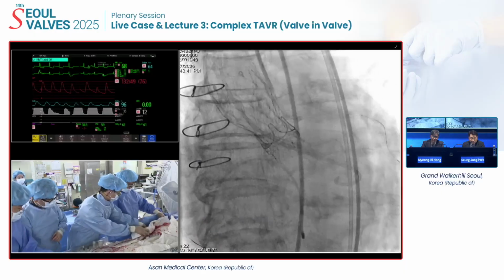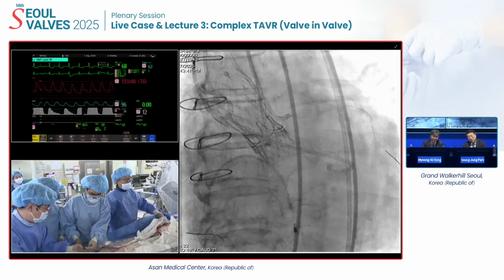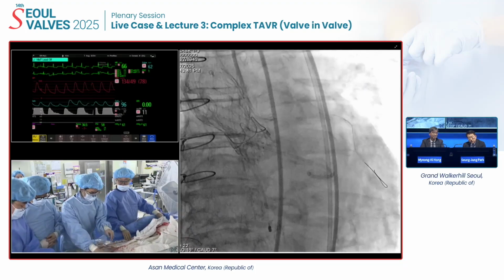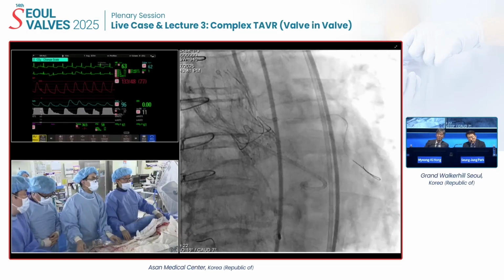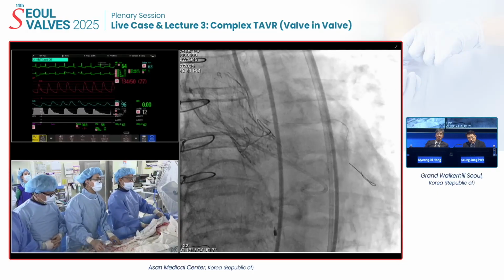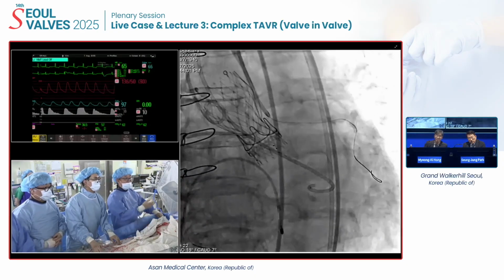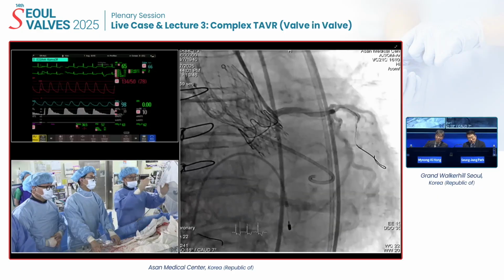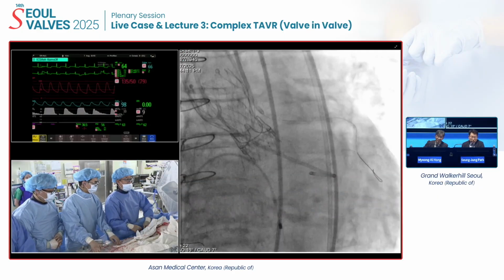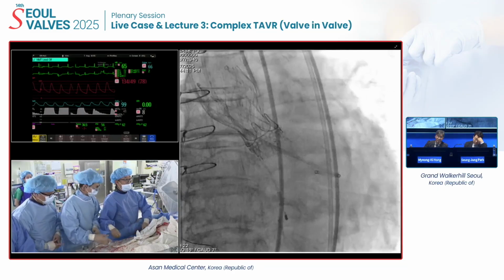레디알로 했지? 요것도 연결돼 있지? 오케이. 연결 주십시오. 오케이, 준비됐어? 테스트? 오케이, 한번 찍어볼게요. 살짝 빼고. 자, 엔조. Yeah, there was some space out of the prior surgical valve, in the sinus space would be okay. So I removed the wire.